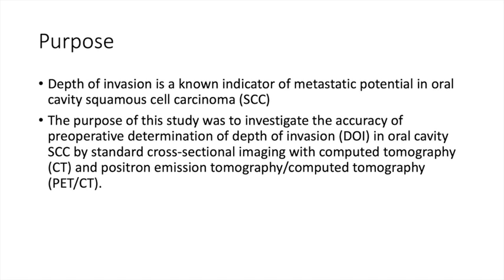We know that depth of invasion is an indicator of metastatic potential in oral cavity squamous cell carcinoma. The purpose of this study was to investigate the accuracy of preoperative determination of depth of invasion in oral cavity squamous cell carcinoma by standard cross-sectional imaging with CT and PET-CT.